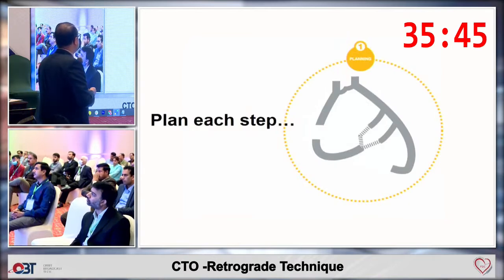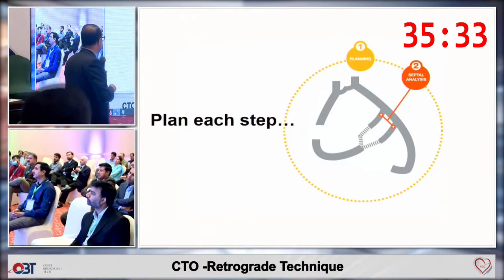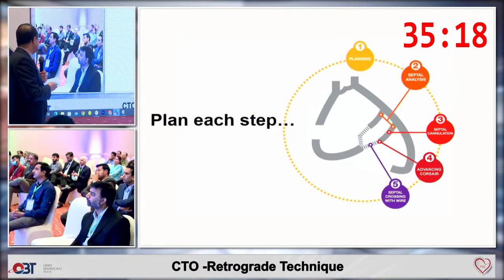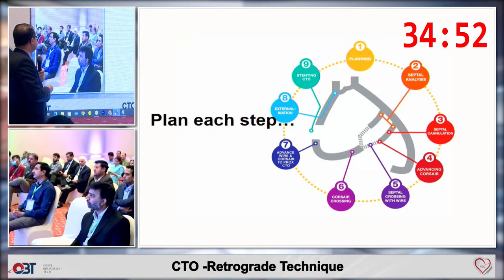So now, how do you do it? Planning is very important. You have to do the septal channel analysis, which you will be using for a retrograde approach. Then you cannulate the septals. Then you advance your wire and Corsair in the septal collaterals. So you cross with a wire into the CTO. Then you cross the Corsair after the wire. So you advance it to the CTO, externalize, and then balloon and stenting. So these are the various things we'll be discussing one by one.